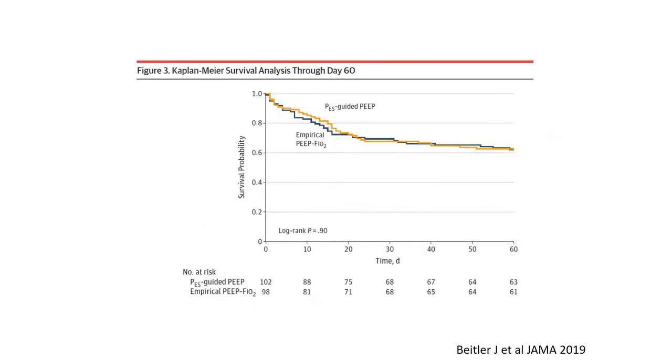They did a second trial, which was unfortunately negative in terms of global outcome. The trial was different. It was a little bit larger, but still approximately 100 patients in each group. But it was compared to the high PEEP FiO2 table, which is different from the first one. And they didn't see a difference in outcome, and so, of course, some people were disappointed to say maybe that's not the ideal way. And that may not be the ideal way.